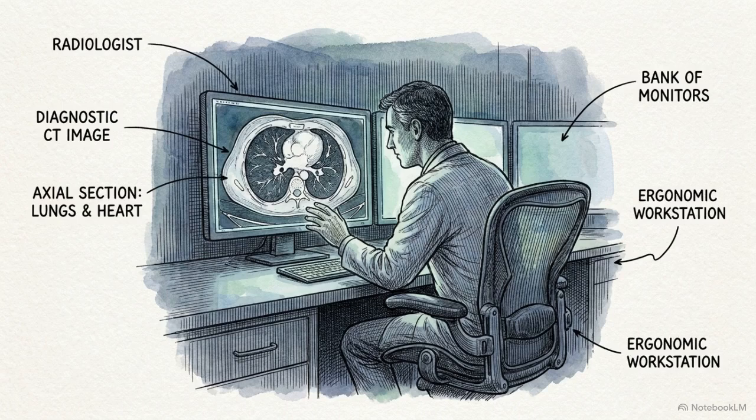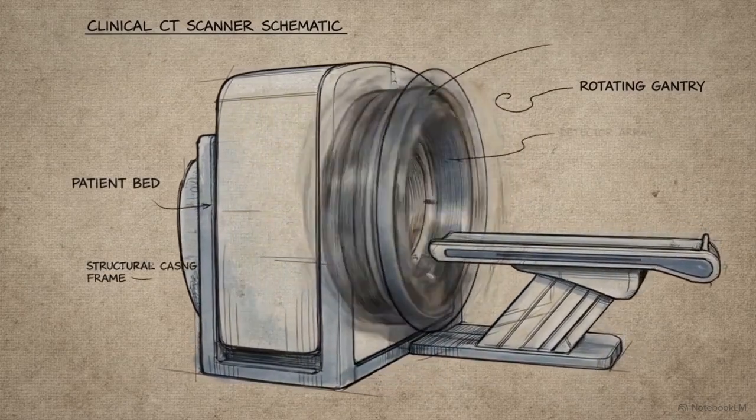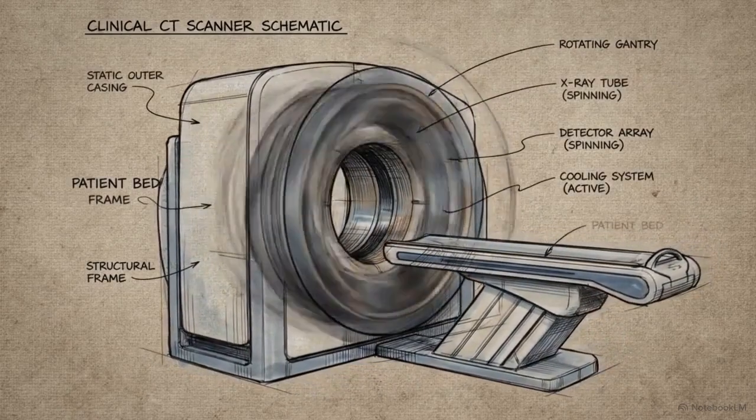The high-fidelity imaging that drives modern medicine is a direct result of this engineering evolution. It requires precisely shaping the photon beam with static filters, while simultaneously pushing the mechanical limits of continuous rotation hardware.